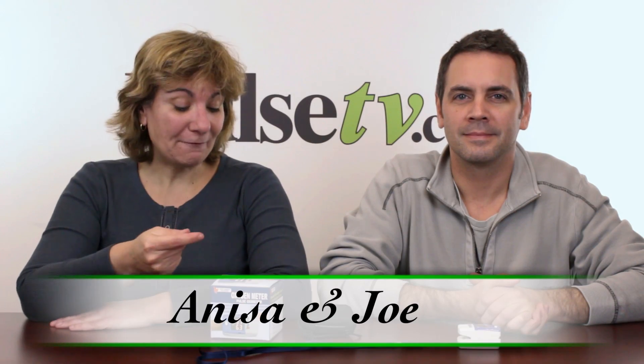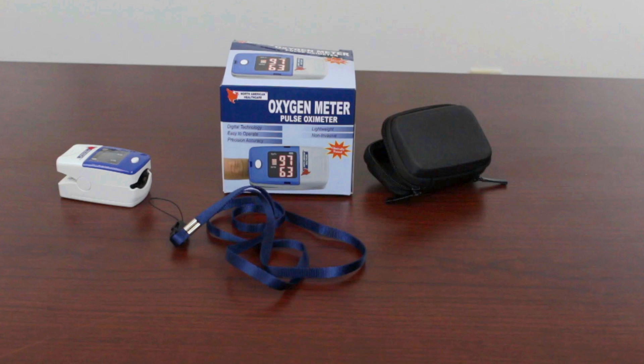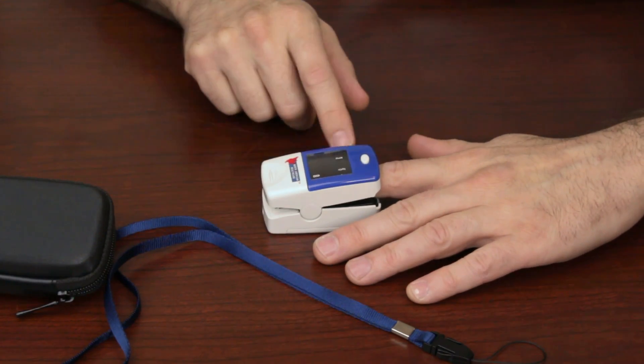Hey, it's Nisa and Joe, and today we've got the oxygen meter for you. This is a great little device — it measures your oxygen saturation in your blood and also your pulse rate. It's very easy to use; it has a nice soft clamp that you put on your index finger or middle finger. Press a button and in 10–15 seconds it'll tell you how saturated your blood is with oxygen.